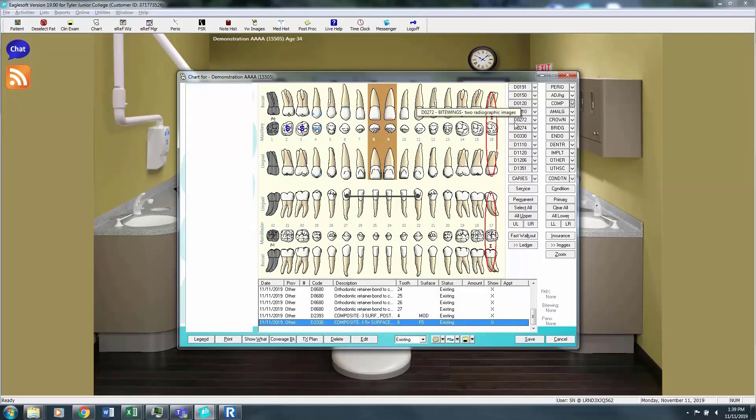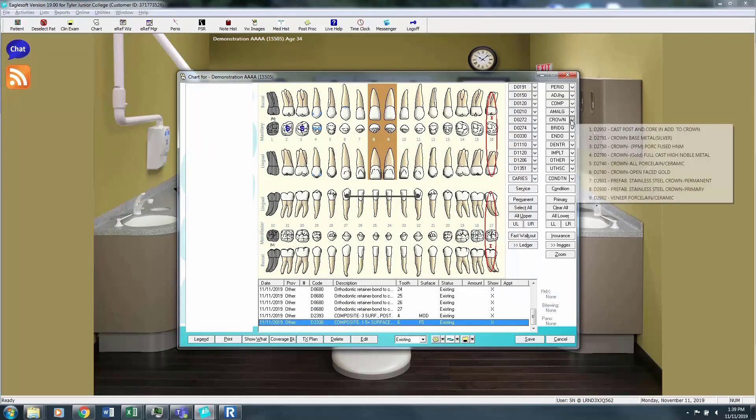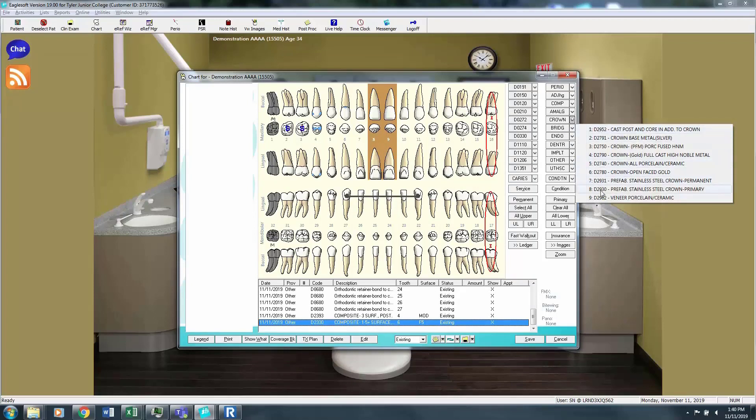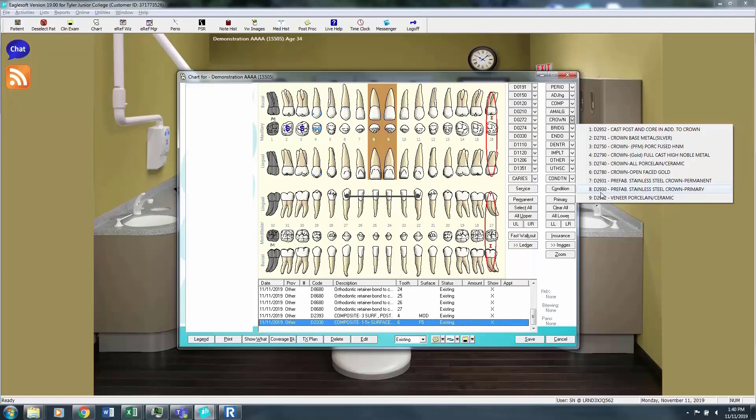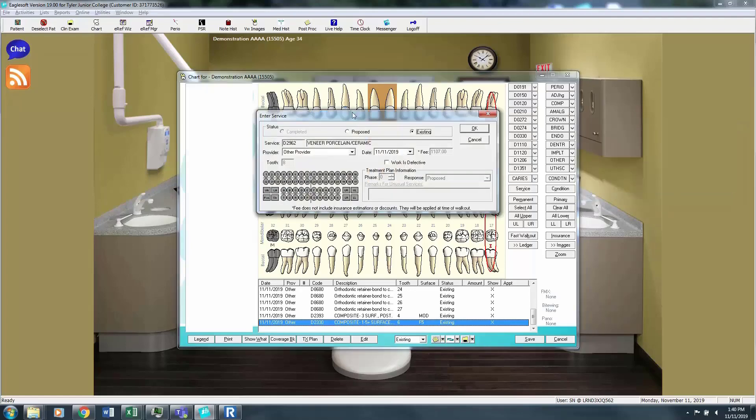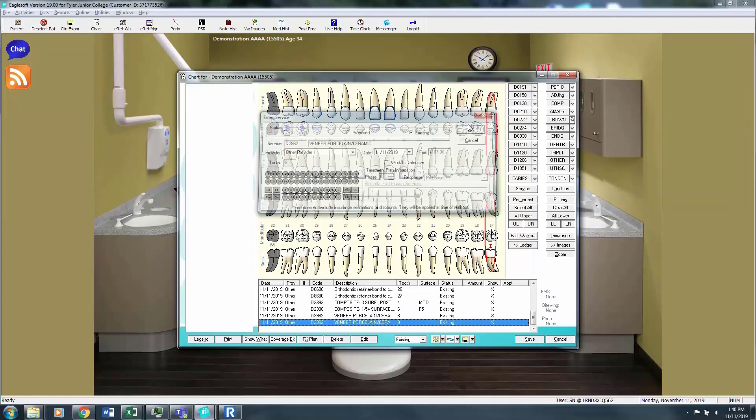Say that 8 and 9 have labial veneers. Now under the crowns make sure you're reading carefully your options. Do we have a porcelain fused metal crown, which is very popular, an all porcelain crown, full gold crown, open face gold crown, prefabricated stainless steel crowns? You must choose if this is on a permanent or primary tooth. And we have the labial veneers.